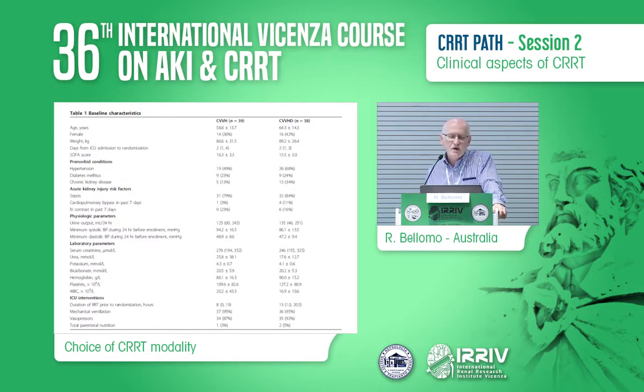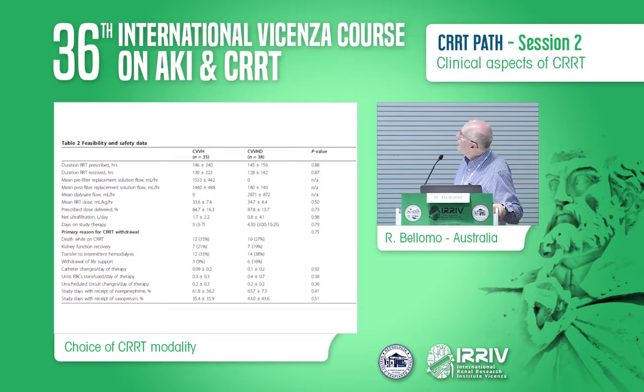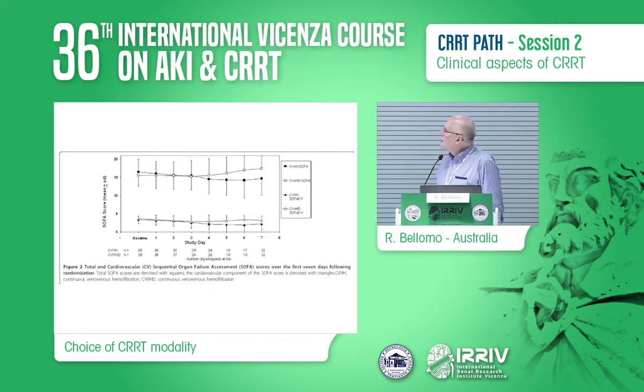The duration of RRT prescribed and the solution flow, the post-replacement solution flow, the prescribed dose, delivery, and so on are presented and are equivalent. Now, the clinical outcome for this study was to see if there was a change in sequential organ failure assessment score when comparing CVVH and CVVHD.